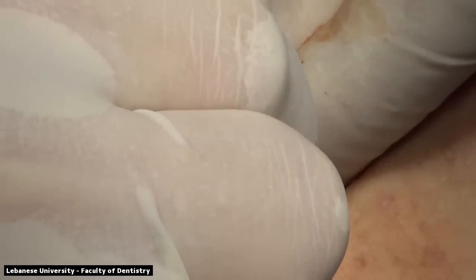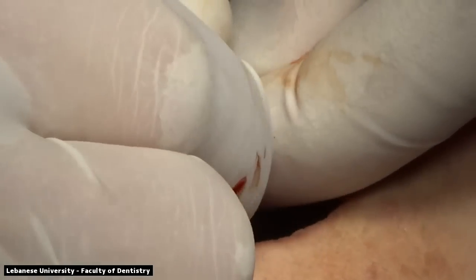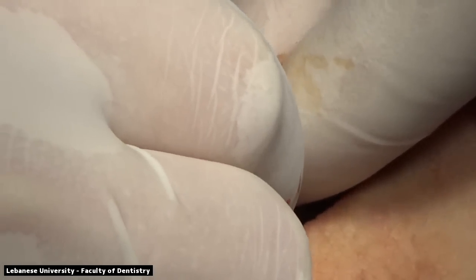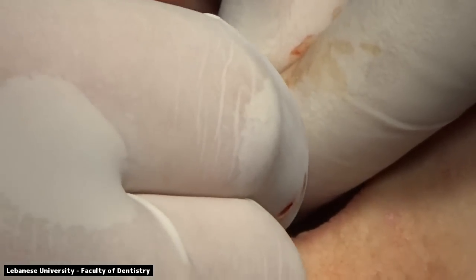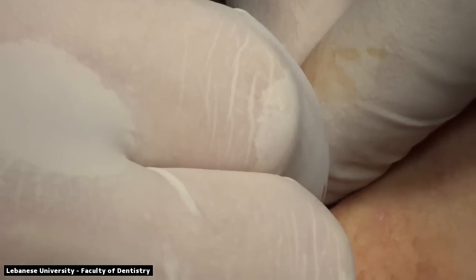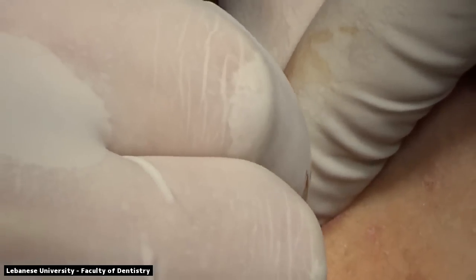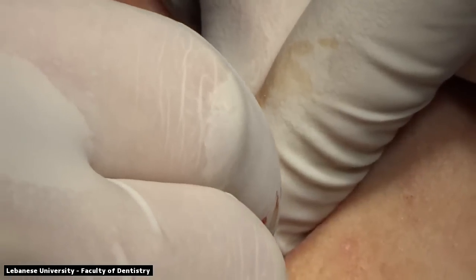As you see from the motion of the fingers right now, we do have some tension and the implant is being inserted with no force and pressure, but at the same time we do have some primary stability and we have some tension at the bone area. We're being very careful to make sure that the level of the implant is at the buccal crestal bone level.